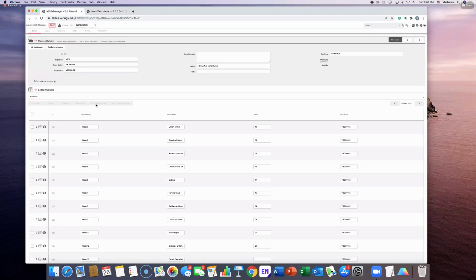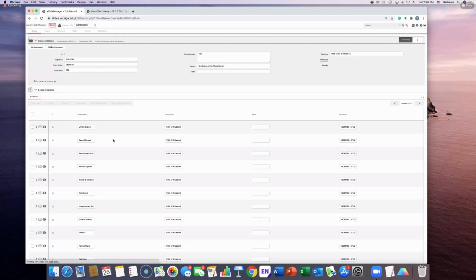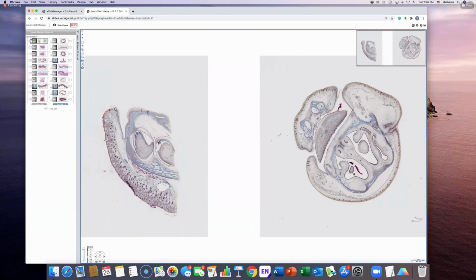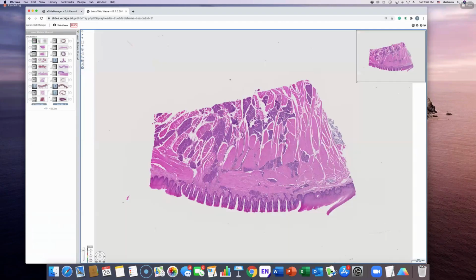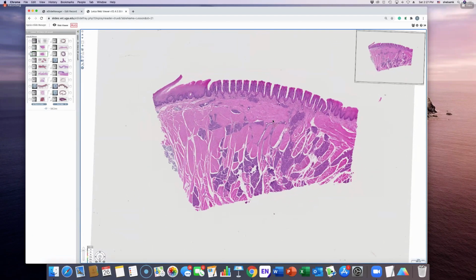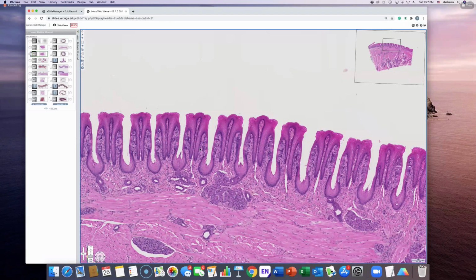Okay, so let's go back to our stuff for courses. Okay, where are we? Okay, let's go look at our tongue. See, in contrast to the filiform papilla, the foliate papilla have these structures. What are they?